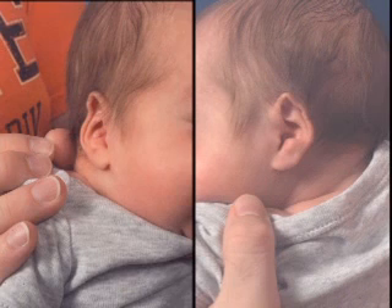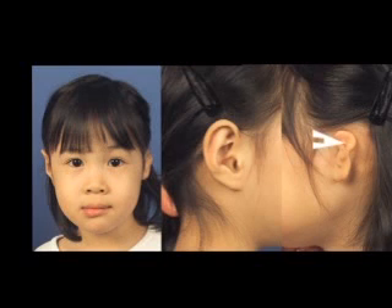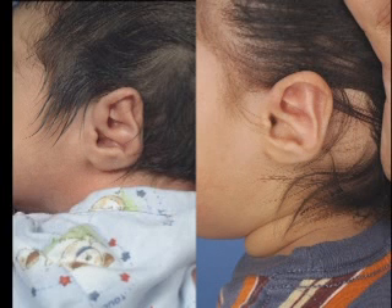There is no absence of skin or cartilage, in contrast to the constricted ear, so helical compression is a true deformation that can be easily reshaped with molding.